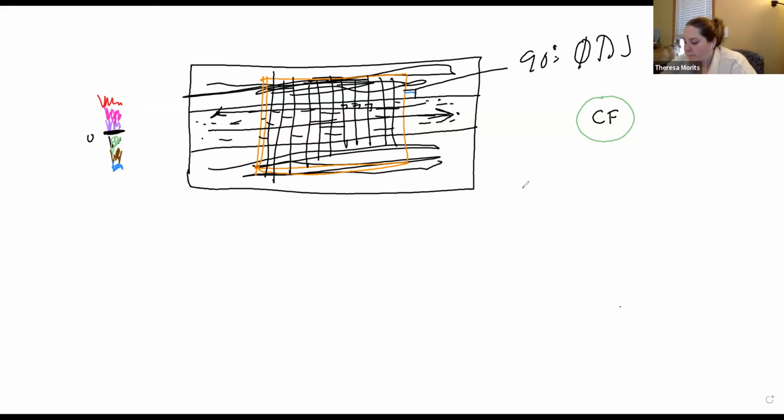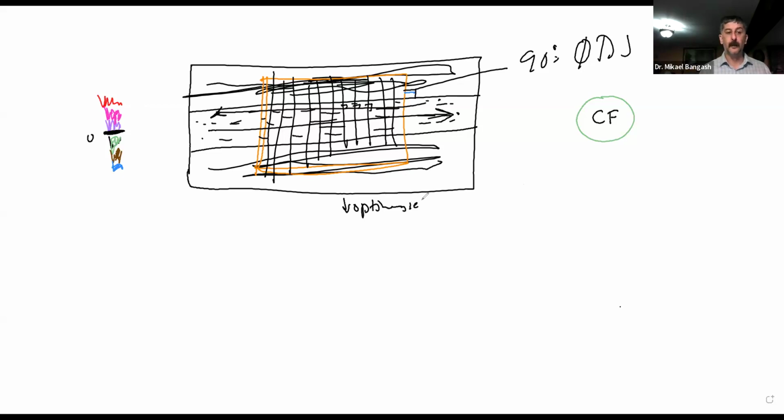Good. So now comes the point to optimize this. What we mean by optimizing is that the blood vessel fills up with some sort of color, since we have our color mode on. And how do we do that?